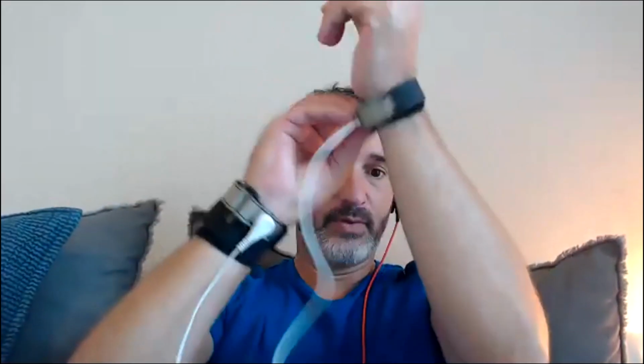If it's black, it means there's no connection. If it's white, it means you've got good connectivity. So sometimes what you can do is take a little bit of water and rub the water underneath the pad, right? I may take the clip off. I may even put a little water here, make sure there's a good connection.